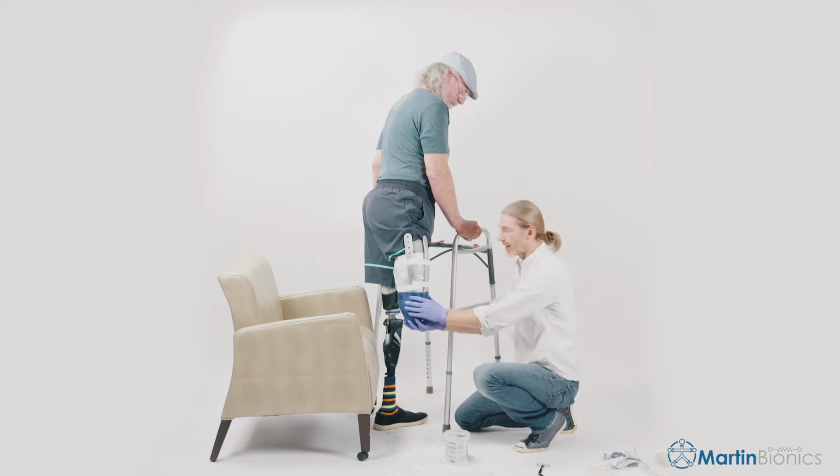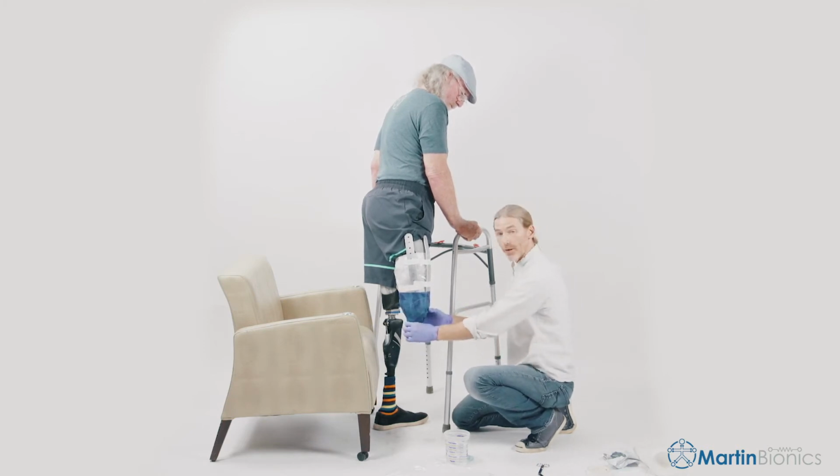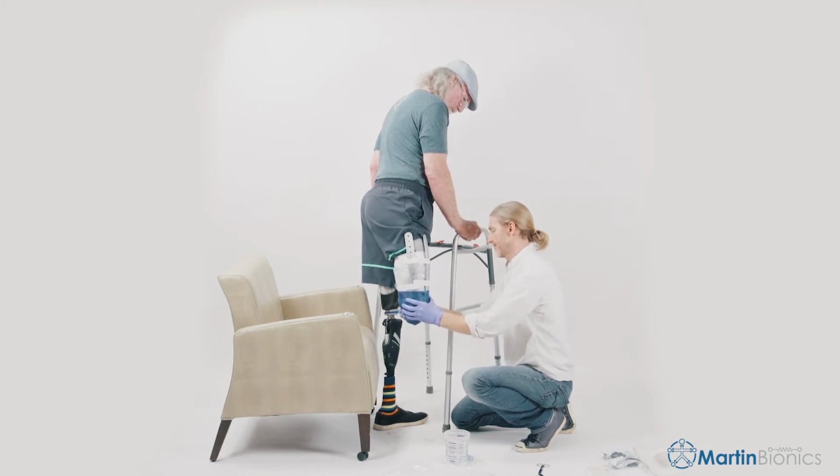So we're just going to let this set off, and then we'll take this back to the lab, strengthen this up, add our components, a little plate underneath to attach the knee onto, and then we'll be ready to attach all of the hybrid components onto it.